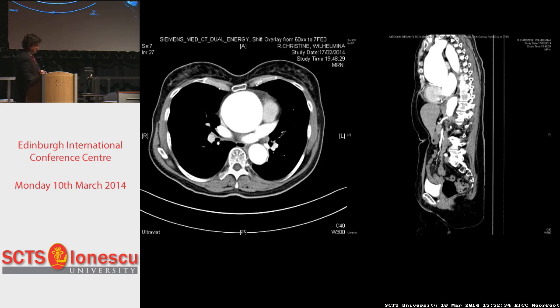Similar case 2 weeks later. A very big aneurysm again. You can see in the sagittal view that it occupies almost part of the chest. This time I was prepared to put the guide wires in the femoral artery and femoral vein. Didn't need to, it was an uneventful entry, managed to cannulate up in the arch without any issues.